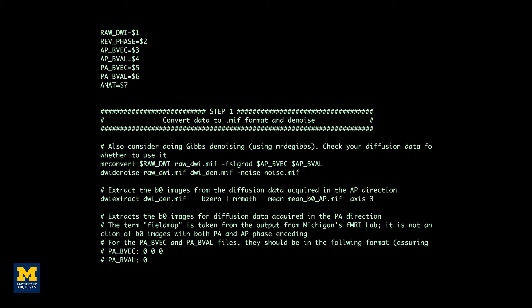First, we will create a template that contains the code needed to analyze a single subject, and then we will use a for loop to automate that analysis for all of the subjects.